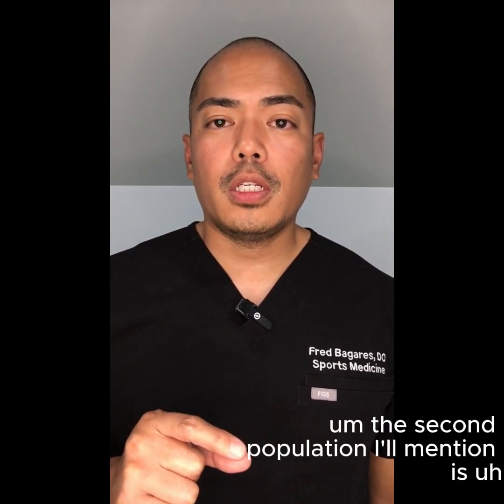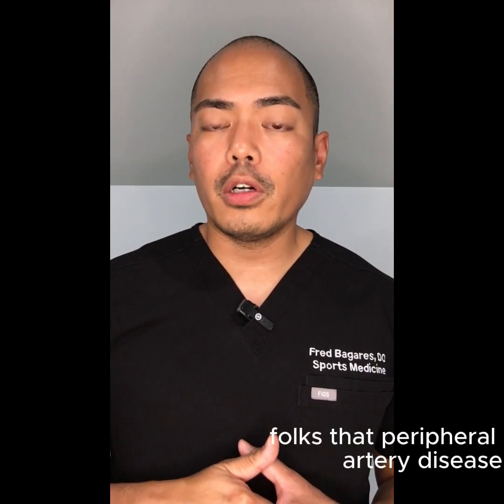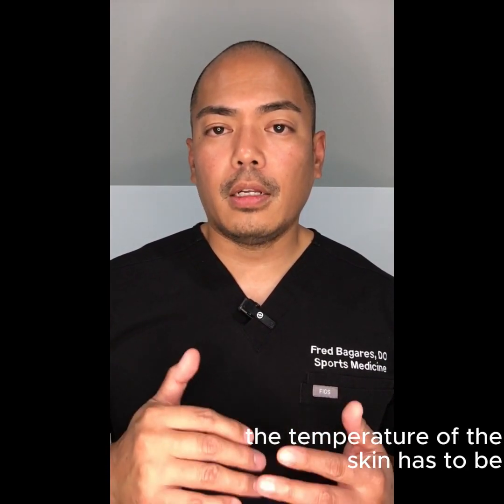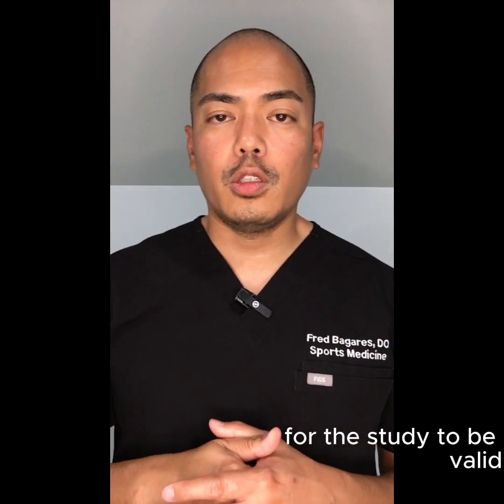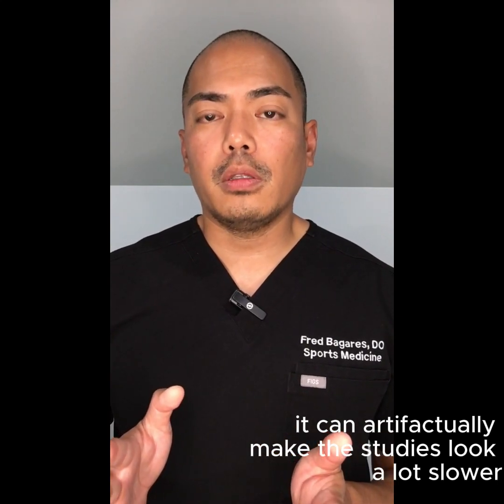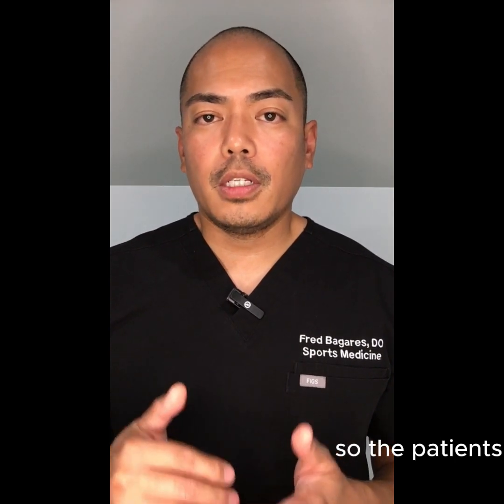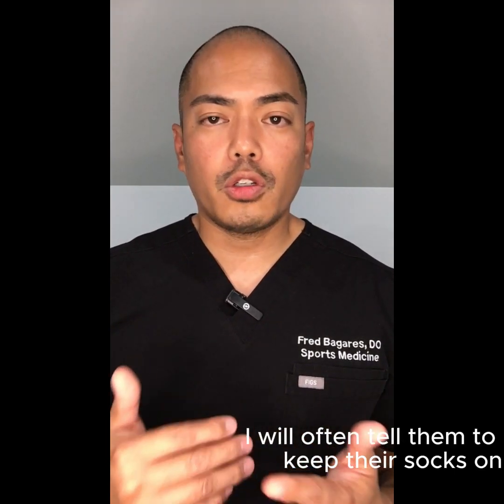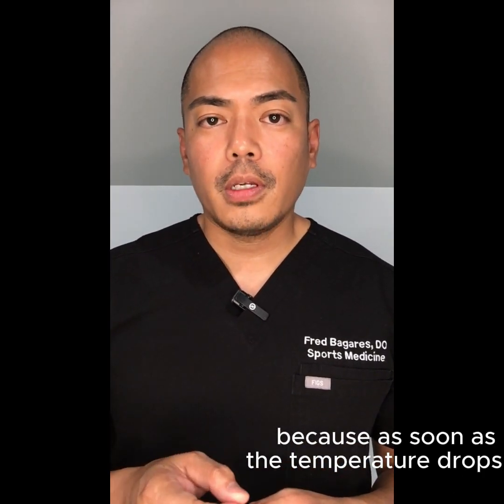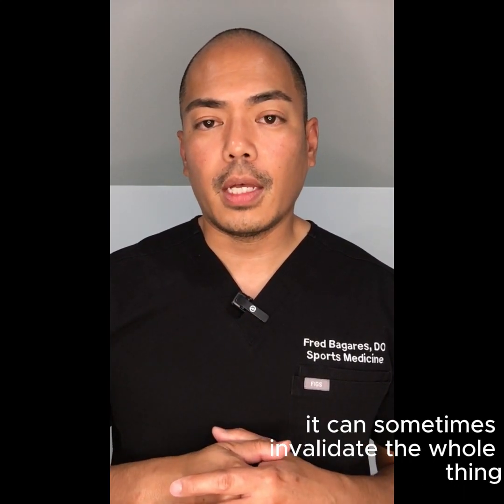The second population I'll mention is people who have very cold feet, folks with peripheral artery disease, Raynaud's syndrome. The temperature of the skin has to be at a certain temperature in order for the study to be valid. When people come in with very cold limbs, it can artifactually make the studies look a lot slower than they really are. So the patients, I will often tell them to keep their socks on, keep their gloves on until the time of the study, because as soon as the temperature drops, it definitely can affect my interpretation of the study, and then again, it can sometimes invalidate the whole thing.